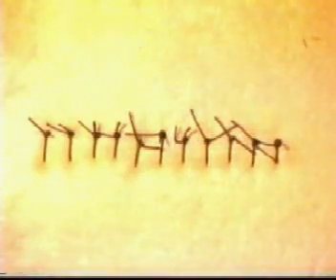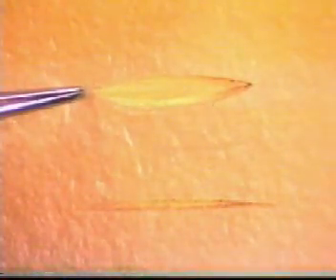Once the wound is closed, ensure that none of the knots lie over the suture line. There may be two types of wound you will be required to close. One, a linear wound, as you see here, the other, an elliptical wound.